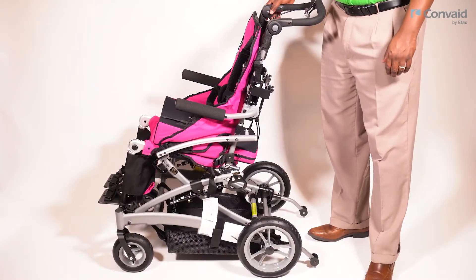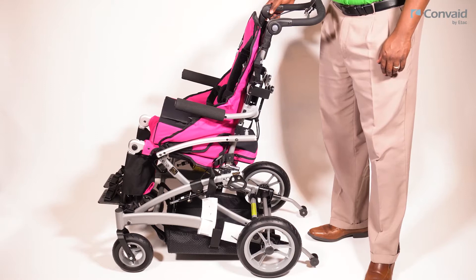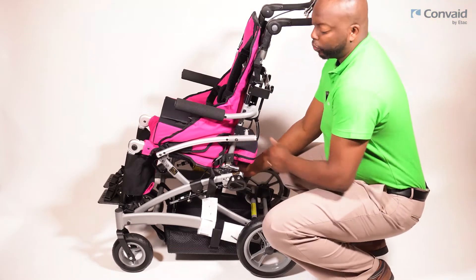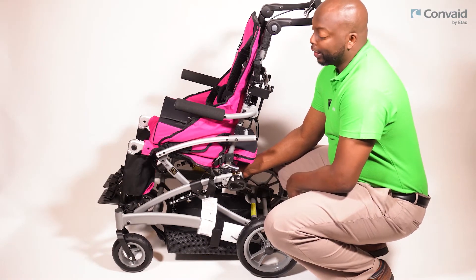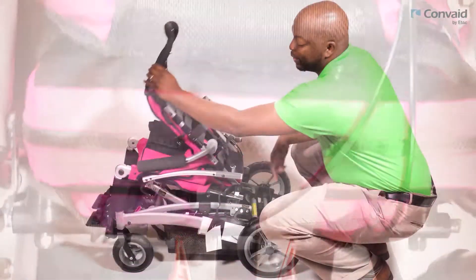The Rodeo has a built-in collapsible feature which allows it to be easily transported. To collapse the Rodeo frame, locate the red levers which can be found at the center rear of the seat. Squeeze the levers simultaneously to disengage the backrest.